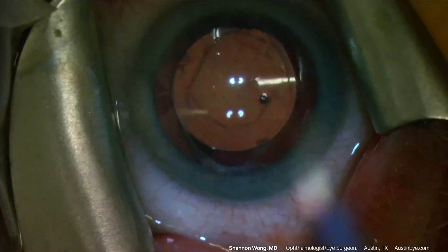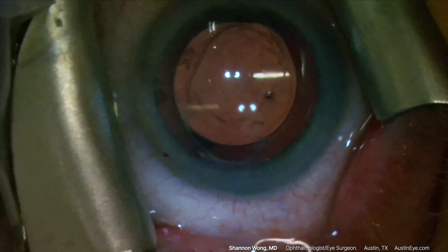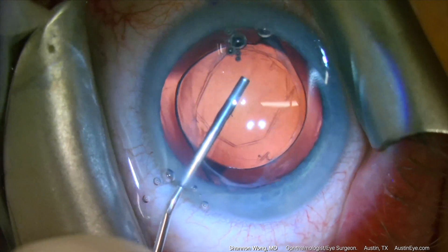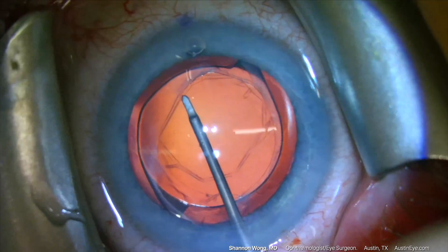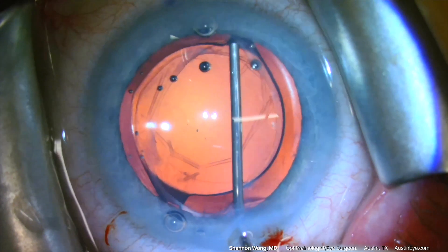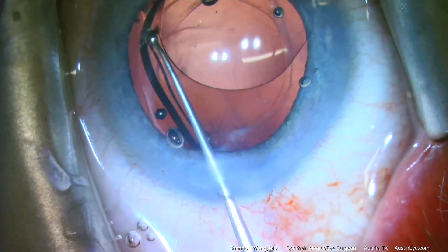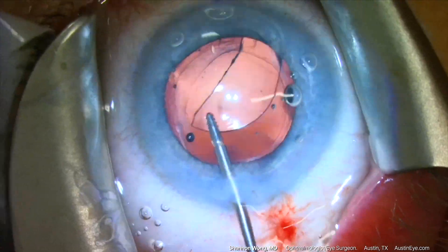Intraocular lens exchange is performed in our usual manner: topical anesthetic augmented with intraocular lidocaine and oral Valium 10 milligrams. We do not use IV sedation in our ASC. Once the anterior chamber is filled with Healon GV, we elevate the anterior capsular rim and visco-dissect the IOL from the capsular bag. The IOL haptics are visco-dissected from the equator of the capsular bag, then the IOL is rotated into the anterior chamber, cut with IOL cutters, and removed in two pieces.